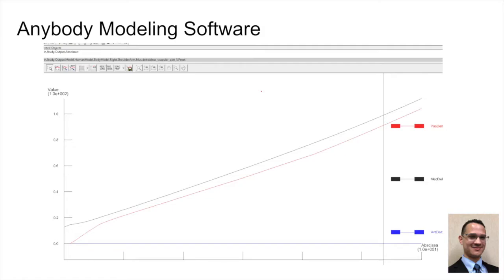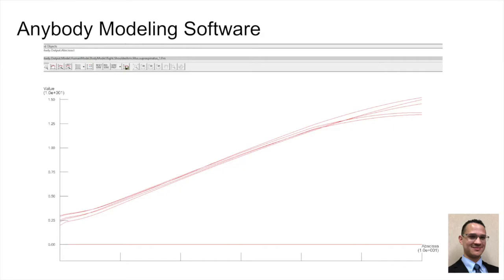The red line represents the posterior deltoid fiber, the black line represents the medial deltoid fiber, and the blue line at the bottom represents the anterior deltoid fiber. Notice that the anterior deltoid fiber is not recruited in the simulation. The net force output from the deltoid is approximately 200 newtons. This graph represents the force output from each of the 6 muscle fibers that model the supraspinatus in AnyBody. The net force output from the supraspinatus here is approximately 67.5 newtons. In summary, the deltoid and the supraspinatus need to exert a total of approximately 267.5 newtons of force to abduct the shoulder 60 degrees.